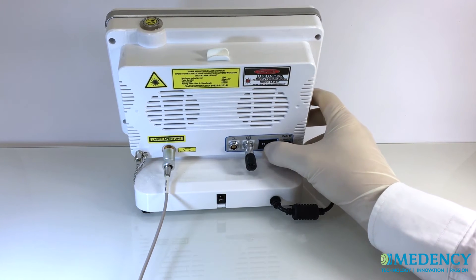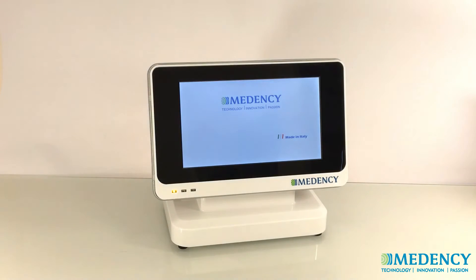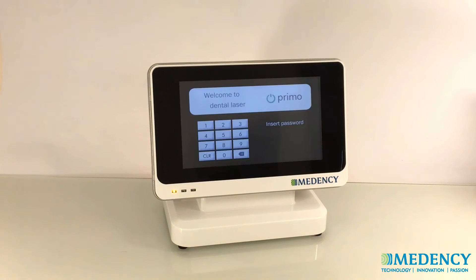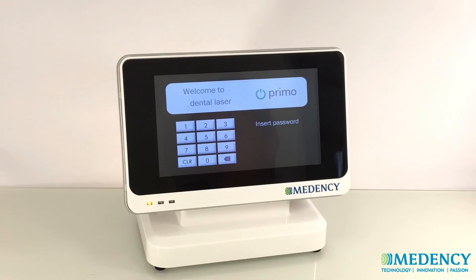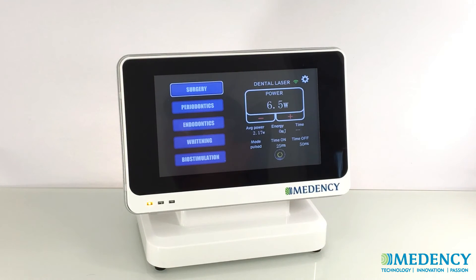Turn the power switch at the rear side of the console to the on position. The MedNC logo screen will appear. After a few seconds, the Primo welcome screen and keypad will appear. Enter the 5-digit key access code, which is 1 to 5. Once the correct code has been entered, Primo will display the home screen, which has 5 favorite treatments to choose from.